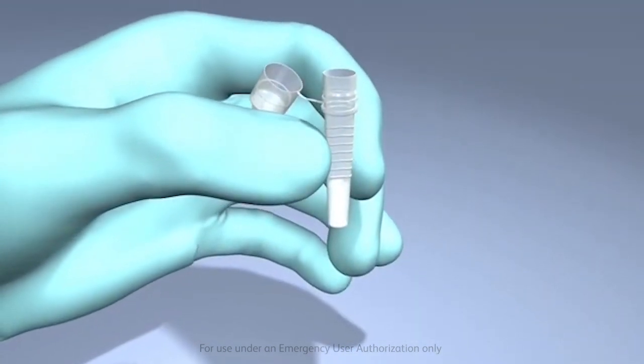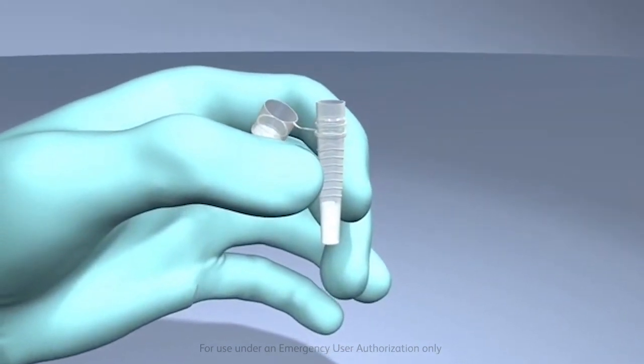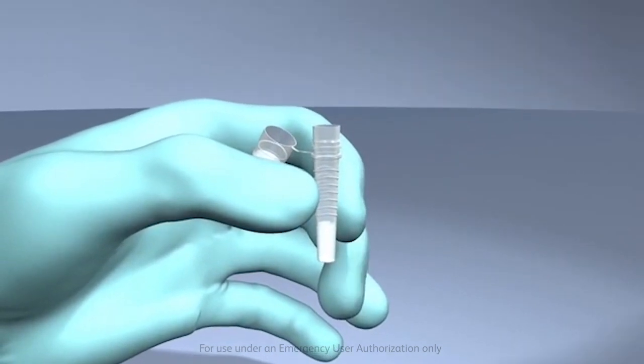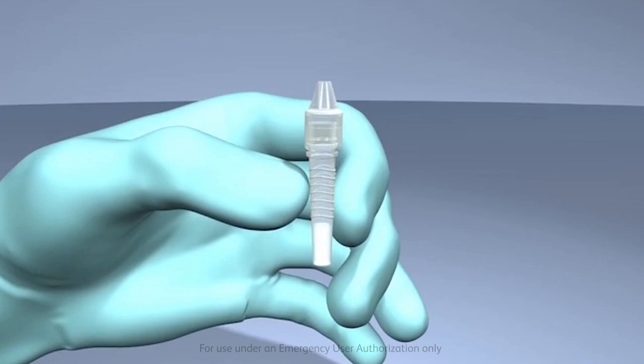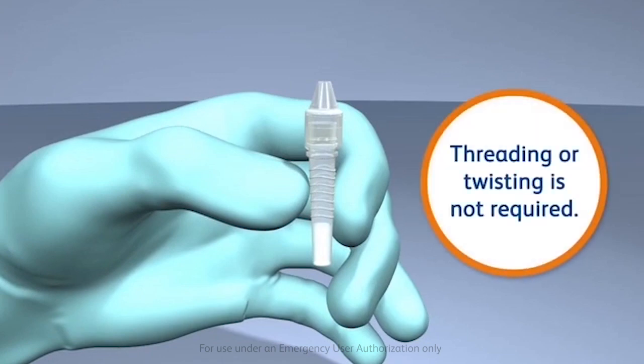Remove the swab while squeezing the middle of the tube to capture the optimum amount of sample in the processing tube. Snap-fit the tip onto the unitized tube containing the processed specimen. Threading or twisting is not required.